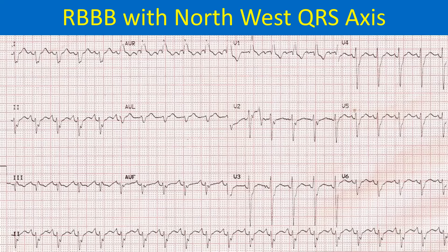RSR' pattern in V1, and RS pattern in leads I, AVL, and V6 are features of right bundle branch block. The amplitude of R waves in the lateral leads is quite low, and QRS width is a little more than 120 ms.